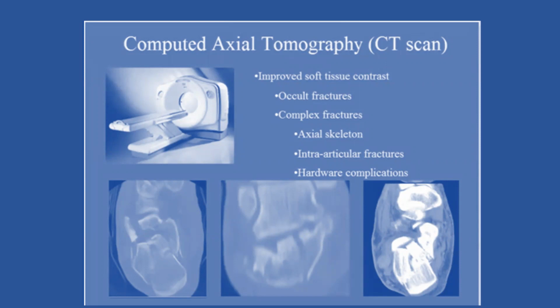Intra-articular fractures, my goodness. I treat acetabular fractures. You don't realize how much CT scan helped us. I'm a fellow who has 50 years of experience. When I first started, there was no MRI, no CT scan. We had to depend on X-rays. When CT scans were discovered, our life became much easier. It tells us about the intra-articular structures. It tells us about the joint congruity. It tells us about so many things. If you look at the calcaneus, when it's comminuted, it describes it much better. So please keep this in mind.